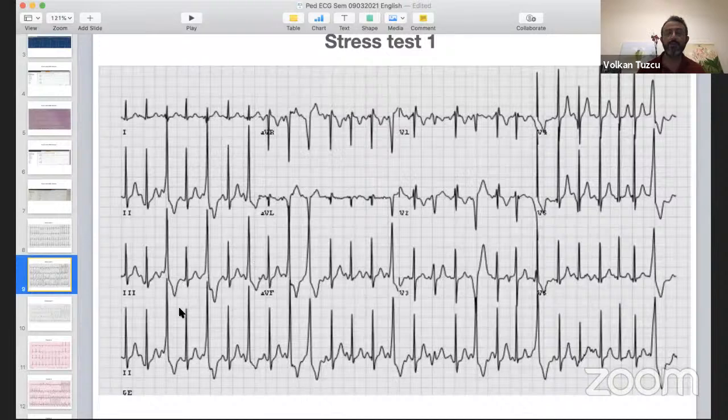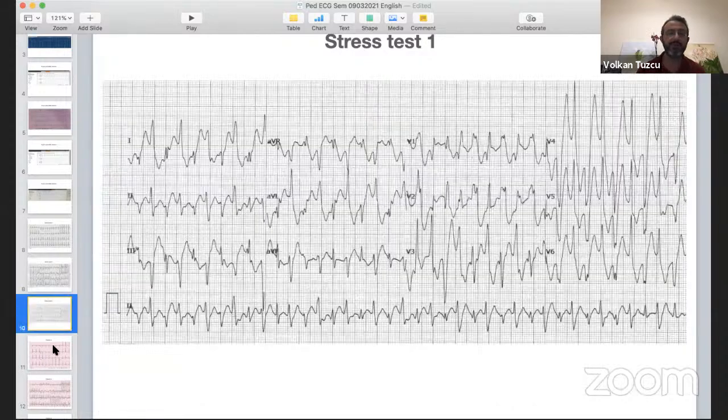There are patients who may start exhibiting only after the heart rate of 140, 150, they start having PVCs. These are CPVT patients actually. Therefore, you have to be very careful when assessing a stress test. Did the patient reach the maximum acceptable heart rate? What am I looking for? So like in this patient, couldn't run more, you can miss actually CPVT. So therefore, anybody with exercise-induced PVCs, like in this case, even if they are uniform looking, you still have to suspect CPVT actually and do things according to that, because there is still possibility, okay?